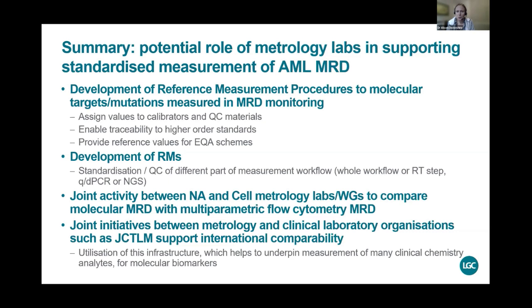The development of reference materials is also important, and as mentioned with the JRC standards, that can be DNA standards, which help support some of the analytical process, but also standards which potentially support the whole workflow, going right back to the actual cells which are being analysed.